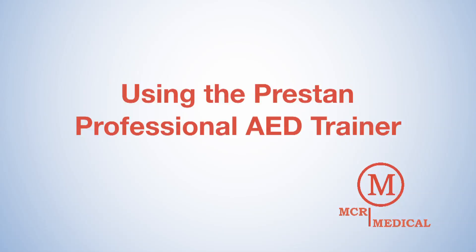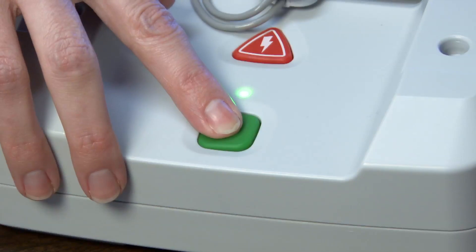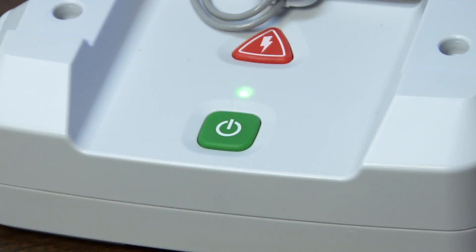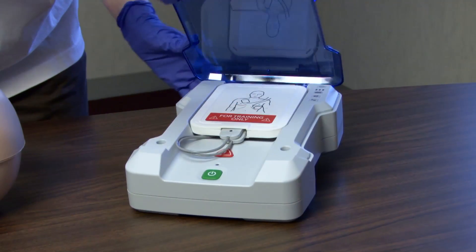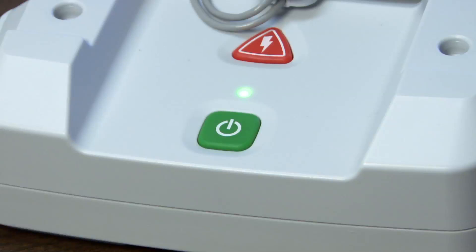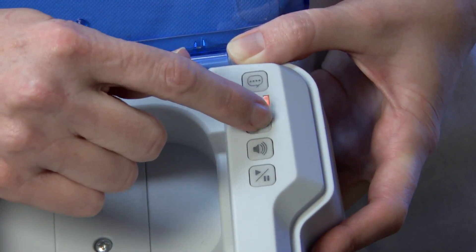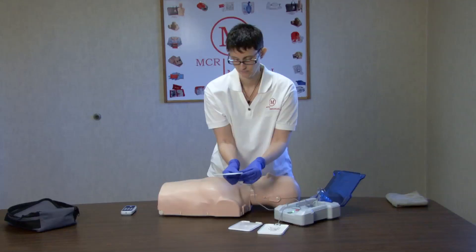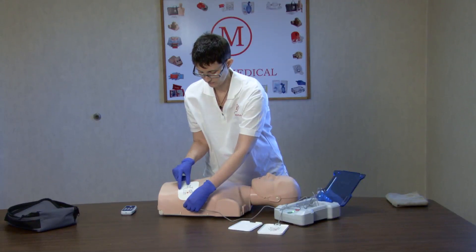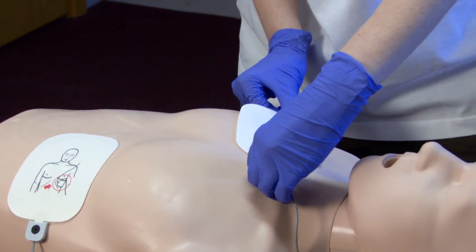Using the Preston Professional AED Trainer. To use the Preston Professional AED Trainer, turn the unit on by pressing either the green On/Off button or push the Language, Scenario, or Volume button. You cannot start the unit using the remote or by lifting the lid. When you first turn on the unit, it will default to the last setting selected. To change a setting, press the Control Panel button you wish to change repeatedly until the desired selection is announced. During class, the unit will guide students through a scenario, asking them to place pads on patients' bare skin, and will repeat the command until the pads are firmly attached to the mannequin. Apply pads as shown in the pictures.